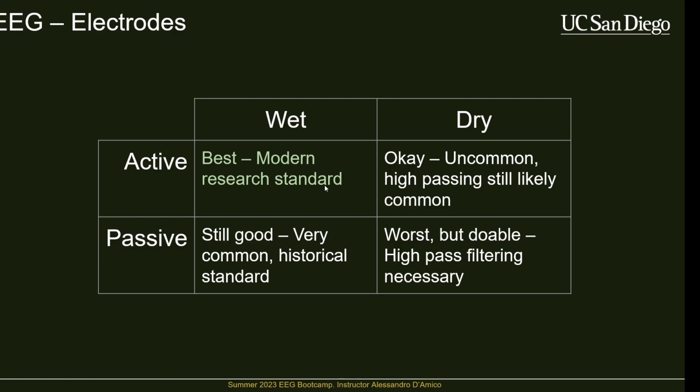Back in the day, like in the 60s, 70s, 80s, 90s, passive electrodes in magnetically shielded rooms were definitely more common. But nowadays, the circuitry for creating these active electrodes is very well understood, and they're cheap to mass produce. Back in the day, people were making their own electrodes, so it wasn't as easy to fabricate active electrodes. But nowadays, this is the industry standard.